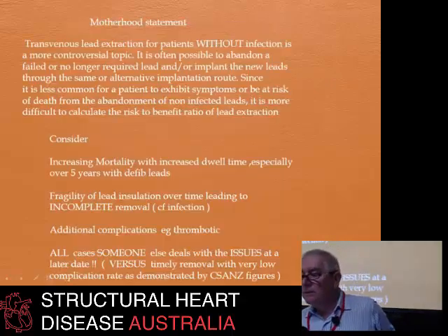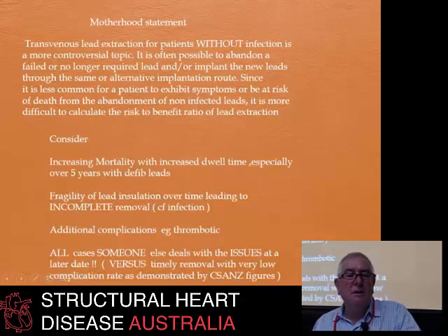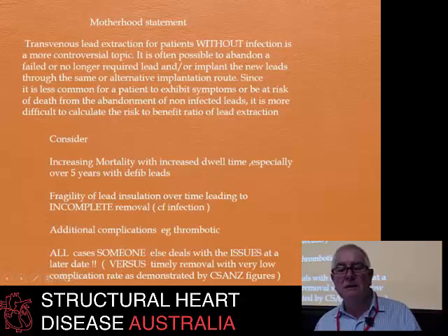When you read through the literature to prepare a talk like this, there are a number of motherhood statements that are made, and there's nothing wrong with them, but they do not take everything into account. So transvenous lead extraction for patients who do not have infection is a controversial topic, and I think that's right. It is often possible to abandon a lead that's no longer required, or to reimplant new leads through the same or an alternative route. Okay, so you're just going to leave the gear you're not using behind.